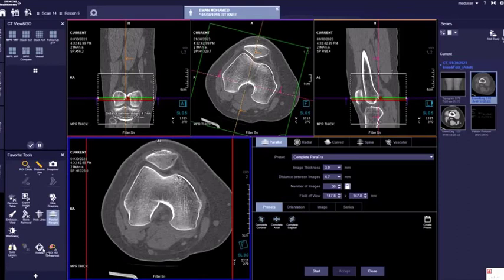The CT of the knee is a very important examination for a lot of patients, so we can find a lot of lesions by CT of the knee, like fractures or fissures in the patient's trauma. So today we will explain that on the CT machine of Siemens, okay? Let us start our exam.